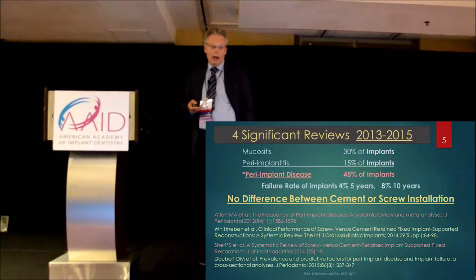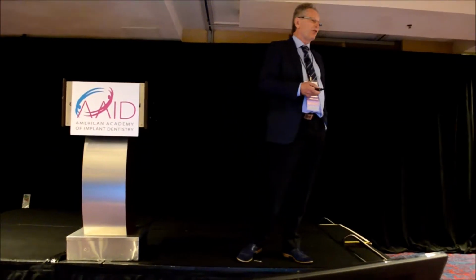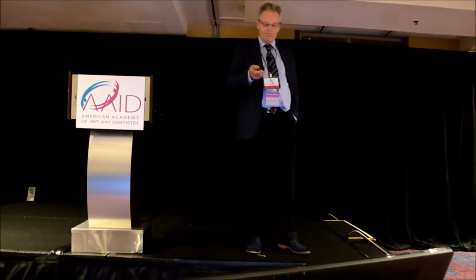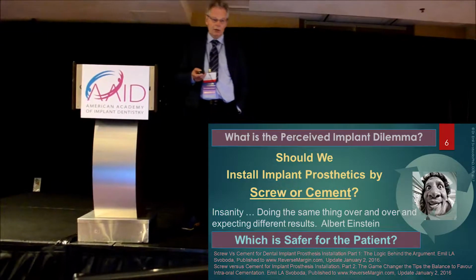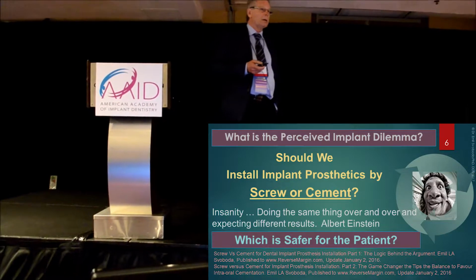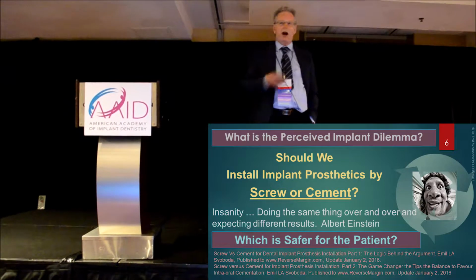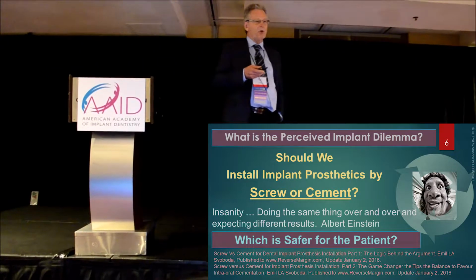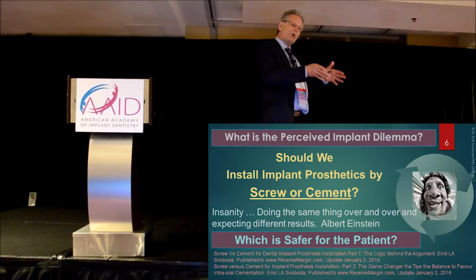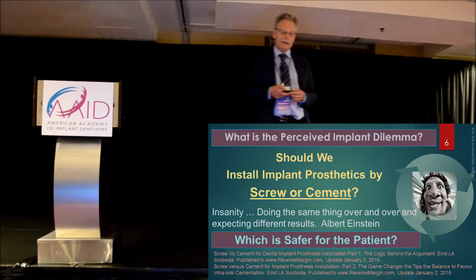And then, well, we know subgingival cement. Cement doesn't belong in a subgingival environment, so that's what we'll talk about too. So what should we do? What's safer for the patient? What I see happening over the last while is we're just spinning. We're just arguing with each other about which is better, this or that. But few people are really delving down deep and seeing what's causing the problem in the first place.